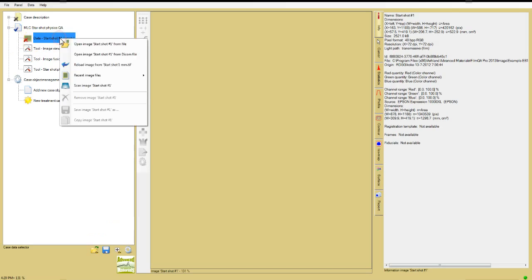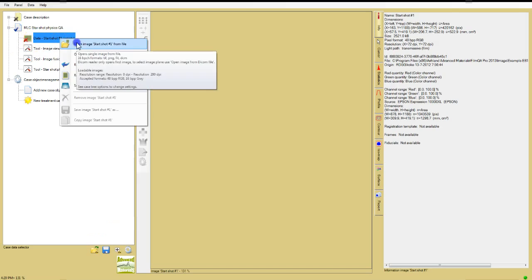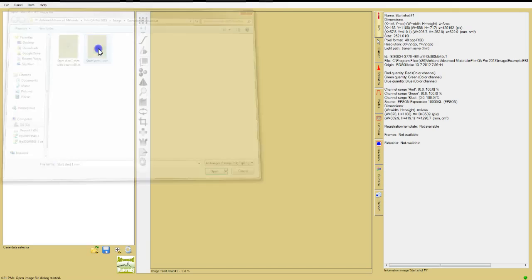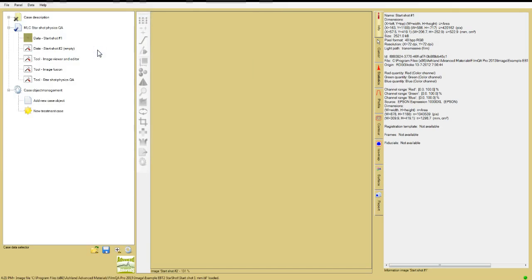Go to Program Files, slash Ashland Advanced Materials, slash FilmQA Pro, slash Images, slash Example EBT2 Starshot, and open the file starshot1mm.tiff.